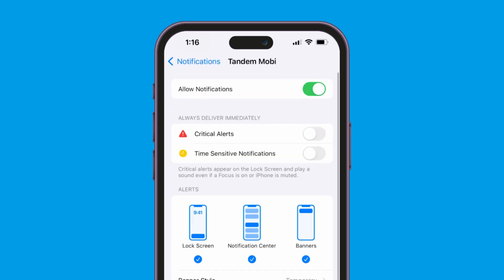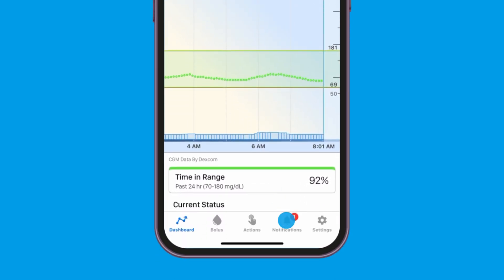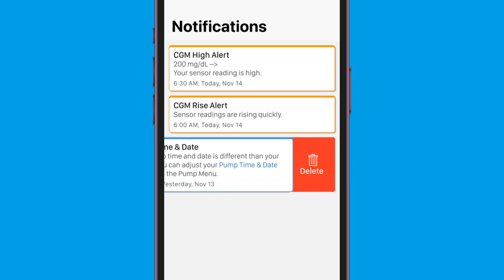We recommend that you turn on critical alerts and time sensitive notifications. We also recommend that you leave the app running in the background and do not close or force quit the app. Acknowledging and clearing alerts within the Tandem Mobi app will prevent the notification from recurring and can also help save your battery life.